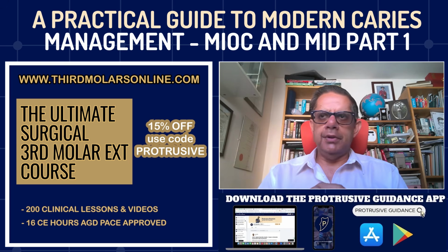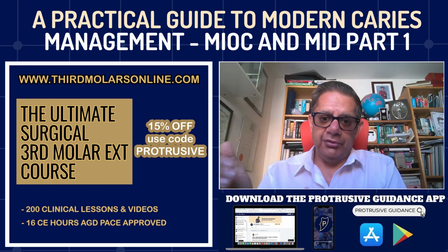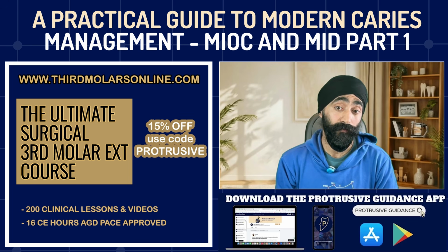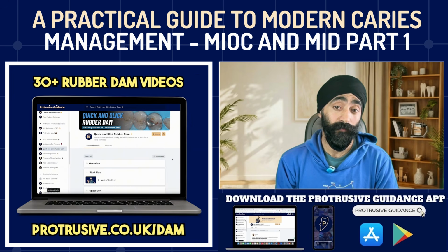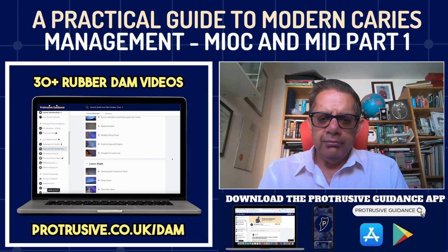And that's great, assuming you've got really high quality radiographs taken with the perfect angulation and everything else. Then you can sometimes see that. That's amazing. But let's be honest, in real life practice, can you see the difference between an E1 and E2 on a radiograph all the time? Of course you can't. No one's fault. No one's to blame.